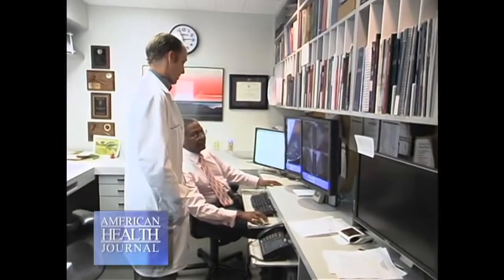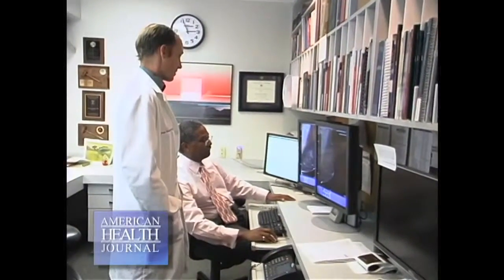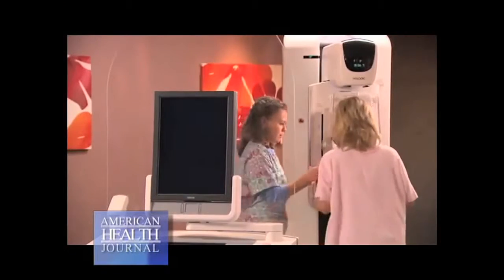What tomosynthesis really addresses is the problem that we as radiologists have with the mimic and a mask. By superimposing shadows, those shadows can mimic something that's important and can obscure or mask something that's not. And tomosynthesis allows us to separate those two shadows in two different planes, and we can look at them separately and separate the mask and the mimic.